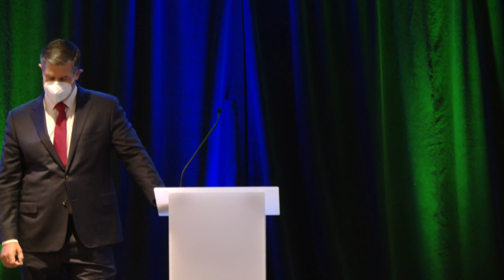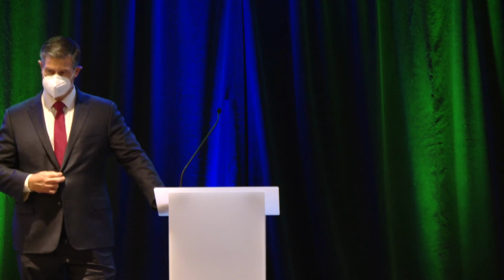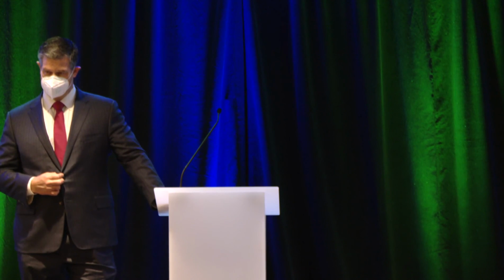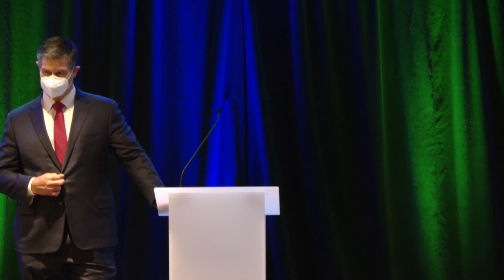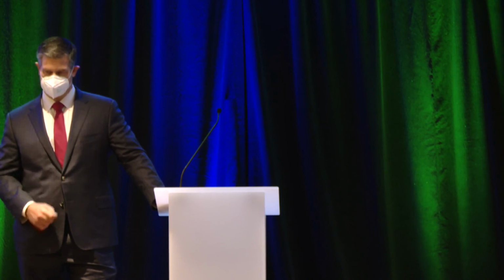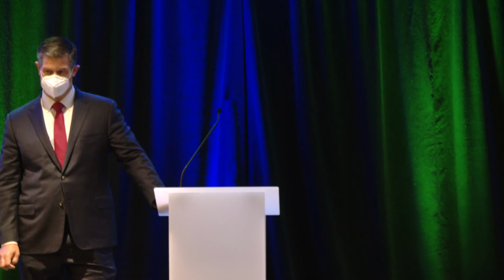So I also have a directorship at one center and read for two other centers where I'm not involved completely. And we also have a lot of patients that we don't see before. Surgeons or other gastroenterologists order the studies. And as you said, it's all in the hands of the nurse who's operating, which sometimes can give you variable results. For instance, how important is it to do the swallows in two different positions in the updated Chicago classification? We haven't really changed that in our center yet because we're having a hard time applying it practically.